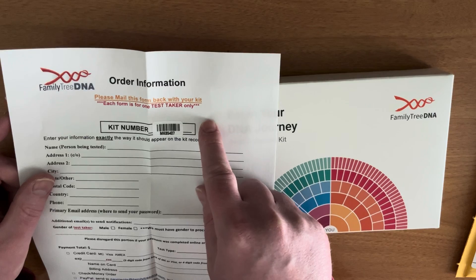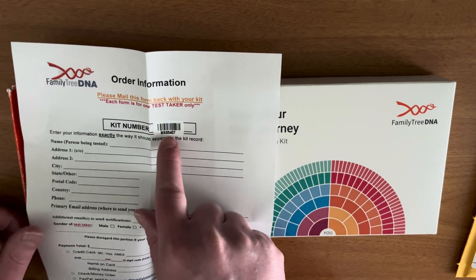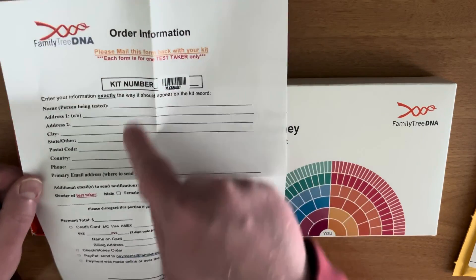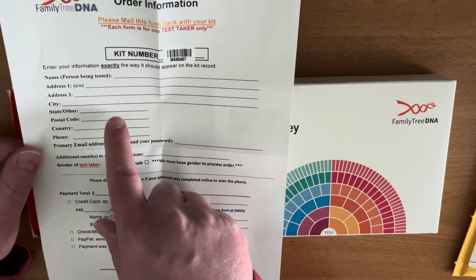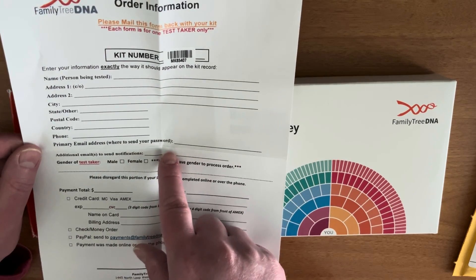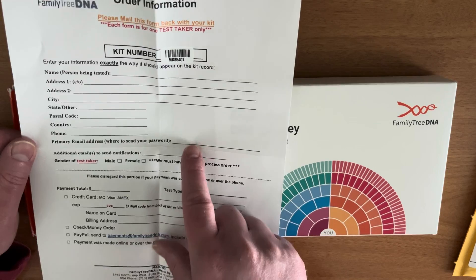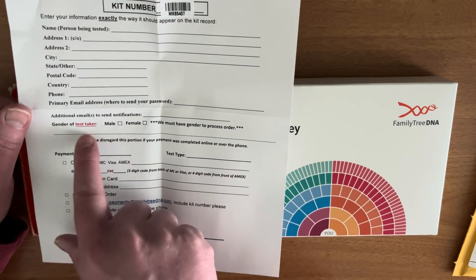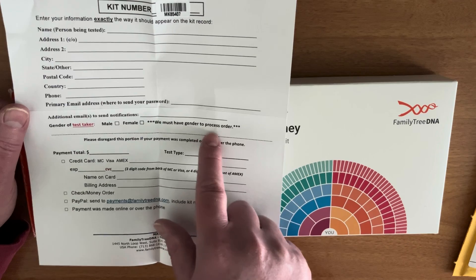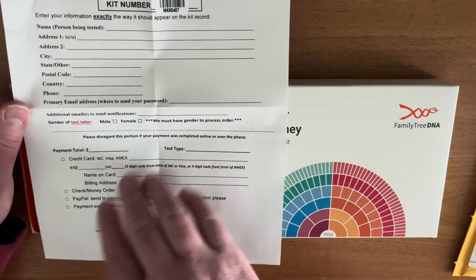Mail this form back with your kit. Make sure that barcode and serial number corresponds with all the other materials you've been given. Enter your information: name, address, postal code, country, phone number, email address — where to send your password. I have the passwords for these kits. And gender of test taker, male or female — they must have gender to process the order. Don't worry about the bottom half, that's all payment stuff that's already been done.